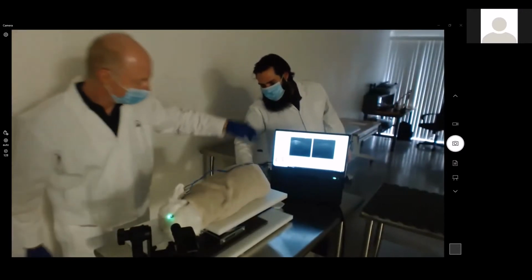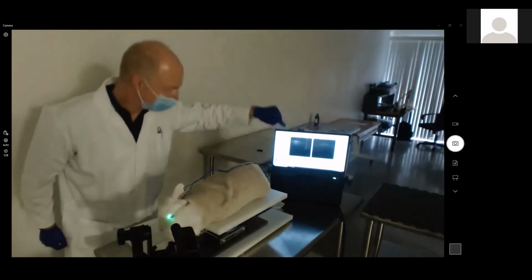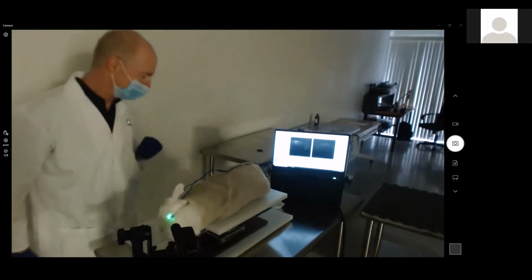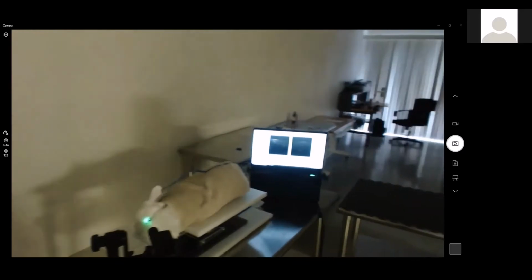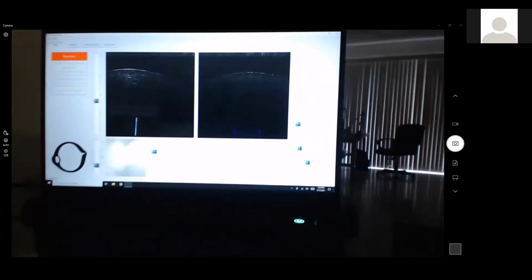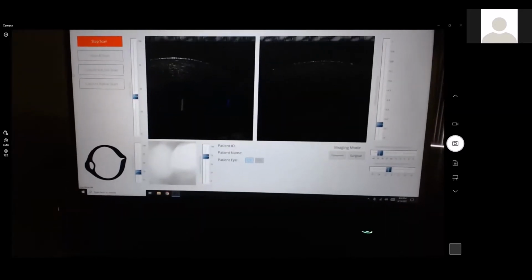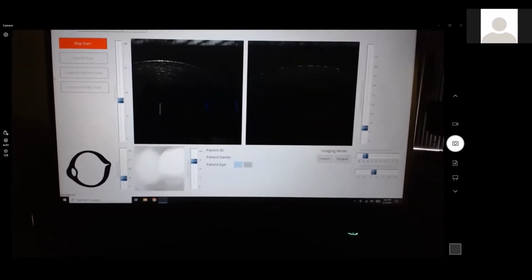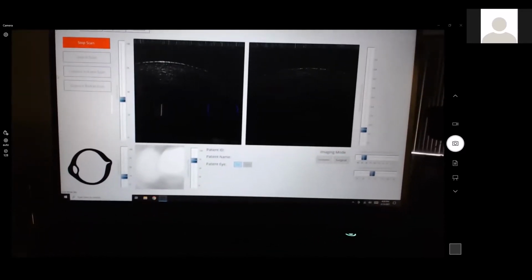You can see that we are currently on the cornea, on the surface of that, and you can see it's coming up on here. That was one of the things we wanted to make sure you could see really well in the process of that. All right. Now we know the resolution is a little hard to see, but you can definitely get layers through. I'm looking at actually a live. You can't see the endothelial very well, but you can see it on our screen on here.